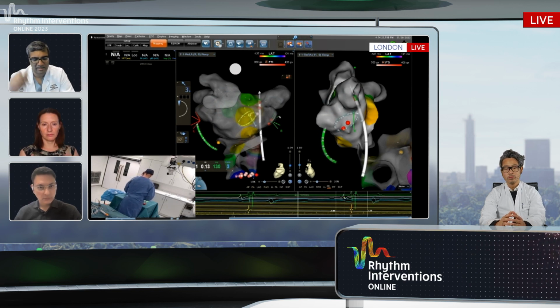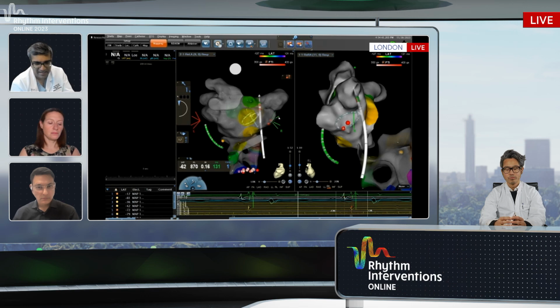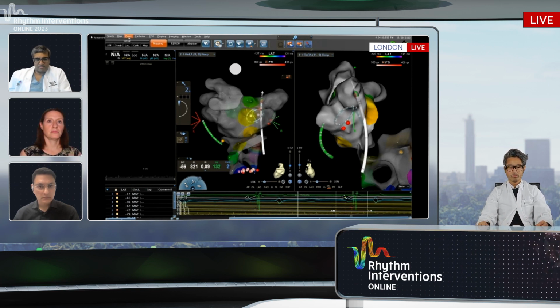I usually put an ablation catheter in the proximal SVC, looking on the right side, and between a CS catheter, an SVC catheter, and an octopolar in the left atrium, usually with about 3 or 4 inductions, you can localize it pretty well. But again, if this patient mainly had typical flutter and not a lot of other evidence of fib, I can certainly appreciate stopping right now.